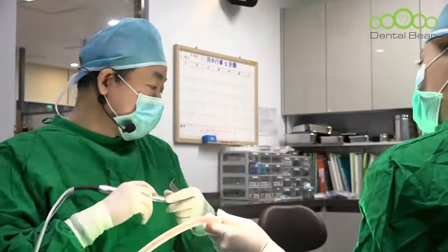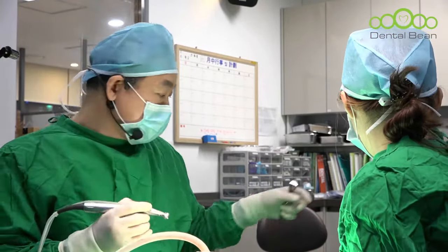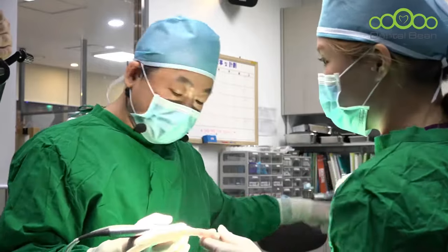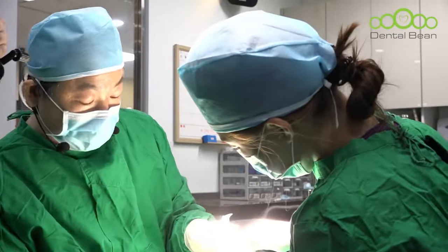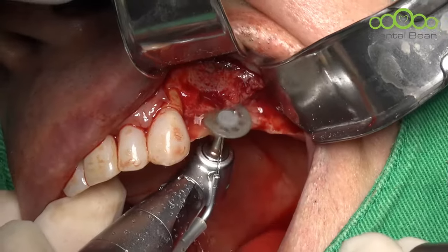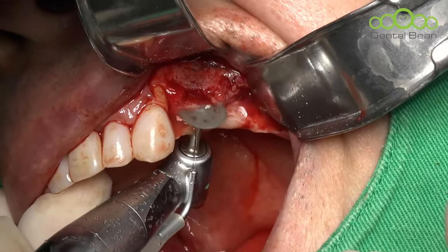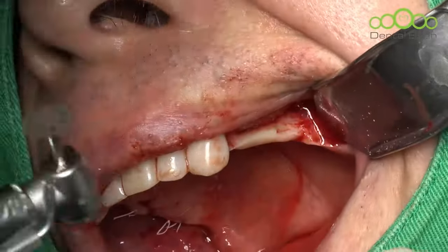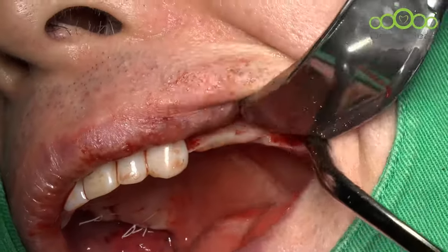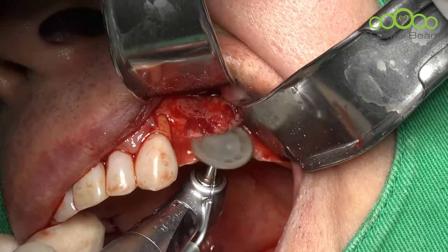So I will try splitting. I will repeat, ridge splitting. Okay, here, carefully use the micro saw, protect the tissue well, and then use the micro saw. Okay. Ideally, the ridge width must be minimum 4 millimeters. If not, after splitting, we need additional graft.